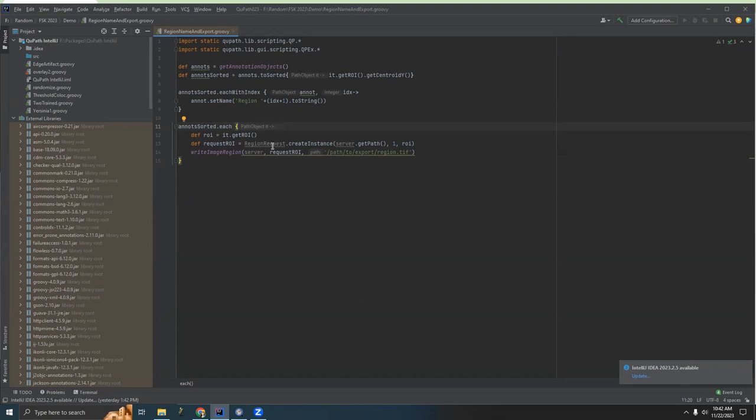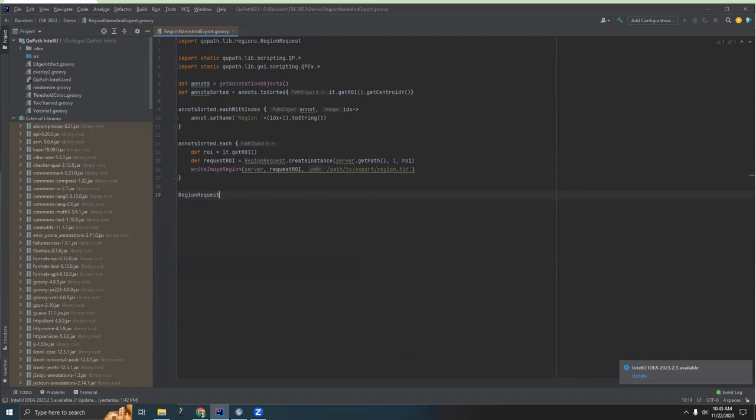And then now that we've defined the region of interest we're looking for, we need to actually request it using what's called a region request. And one of my favorite features of IntelliJ is how it can smartly figure out import statements. So this is grayed out, showing that as of this moment, it doesn't know what this is. It doesn't recognize region request. But if you just go to a brand new line and start typing region request, and hit tab, it finds what it thinks is the best import statement, and imports qpath.lib.regions.regionrequest. And that is the one we're looking for. How convenient is that?